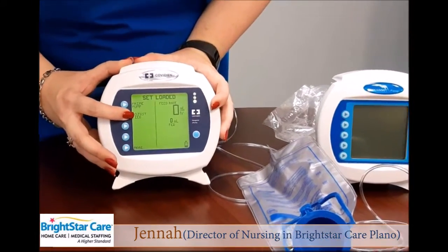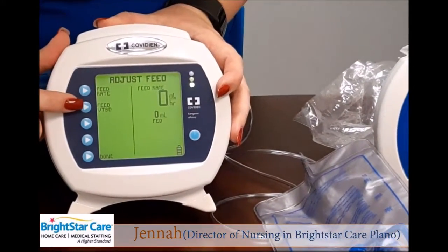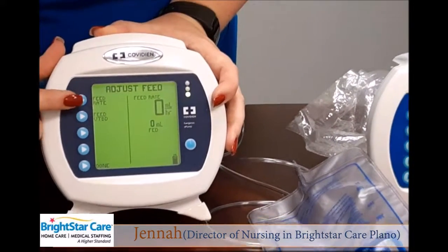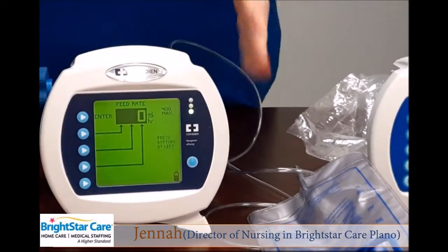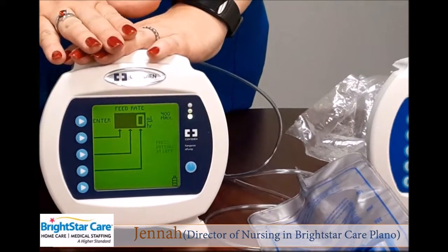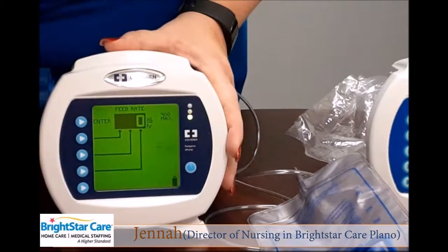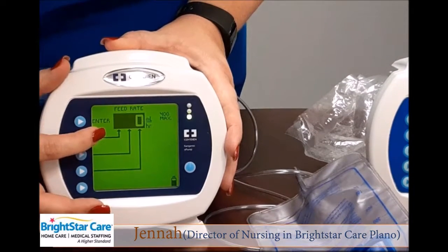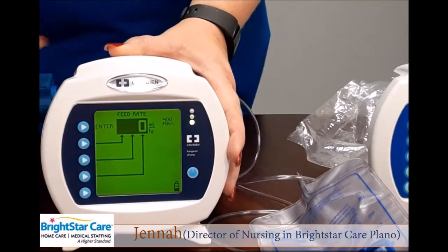So if you're going to adjust your feed, you'll then have two choices, a feed rate and a rate for VTBD, which is your volume. We're going to adjust our feed rate, and you'll notice that this screen has several lines and arrows. So this is going to take you back to when you were in elementary school and you had to worry about whether things were in the ones place, the tens place, or the hundreds place. If you notice, you've got a line and an arrow for your ones place, your tens place, and your hundreds place. In this instance, we're going to say our physician wants us to infuse at 45 cc's an hour.